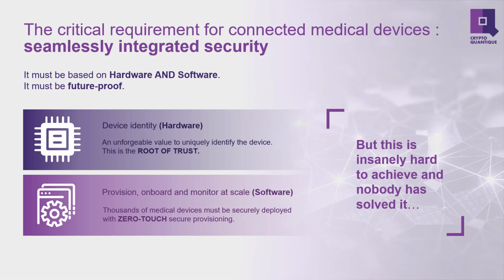So let's have a look at the software side. The software must be able to provision, onboard, and monitor the devices securely and at scale. Thousands of medical devices must be securely deployed with zero-touch secure provisioning. What that means is that the provisioning of these medical devices must be allowed to be done without having to trust third-party companies to program them with secure information.